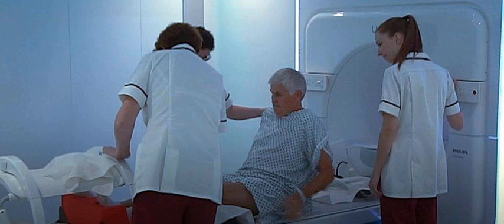Dr. Alison Wood, consultant cancer specialist at the Royal Marsden, described the new technology as a vision come true that would allow clinicians to deliver more targeted, higher doses of radiation, sparing healthy tissue. "In lung cancer, we would love to offer high doses of radiation therapy but are limited because the tumor is often close to some important structures in the chest," she said. "This allows us to see the cancer more clearly and make sure the radiation goes where it is needed and not where it can cause damage."